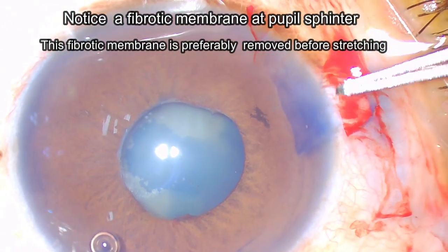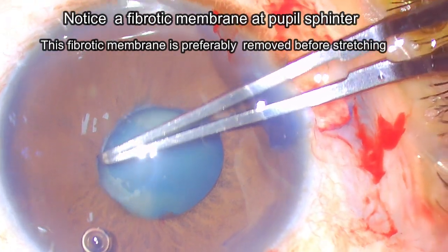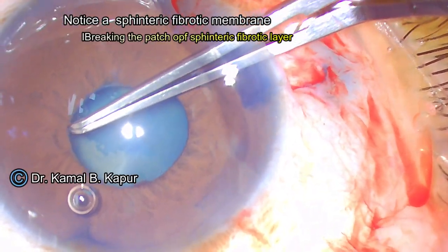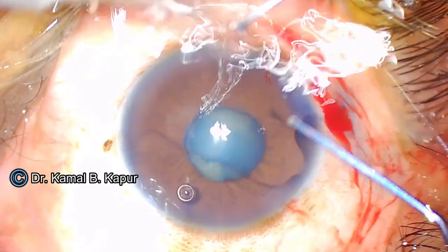Before we use two instruments to dilate the pupil, we will break the sphincteric fibrotic membrane. It is important to break this membrane in pieces, because wherever you break the membrane is the area where the pupil will actually be helped to dilate and stretch.